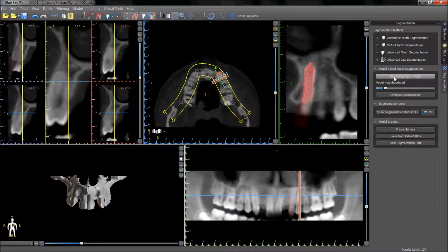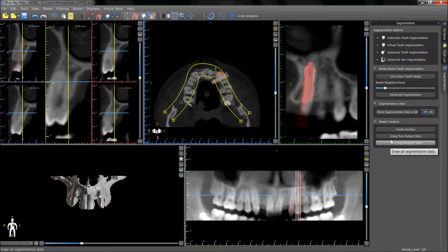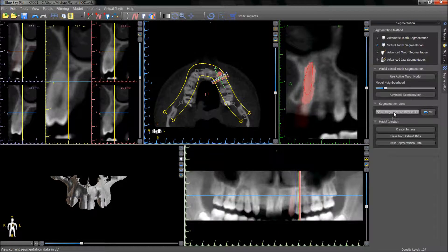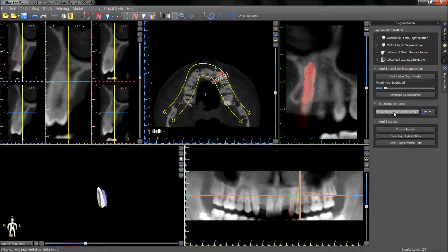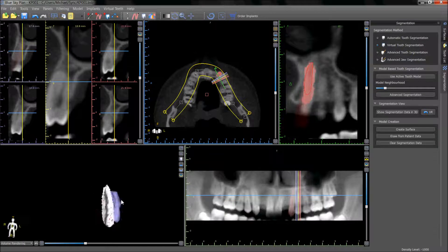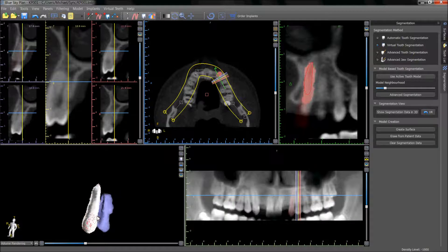We then have the same options to proceed with creating the surface, erasing from the patient data, or undoing the selected area. Show segmentation data in 3D will show us how the extracted segmented tooth will look.